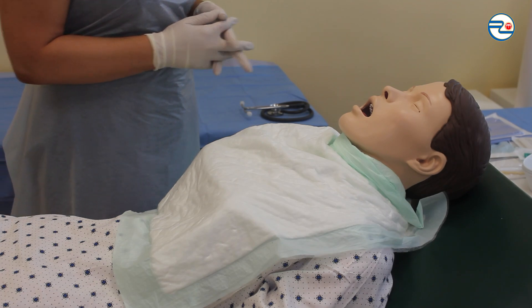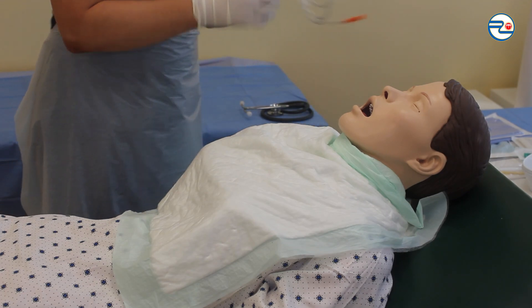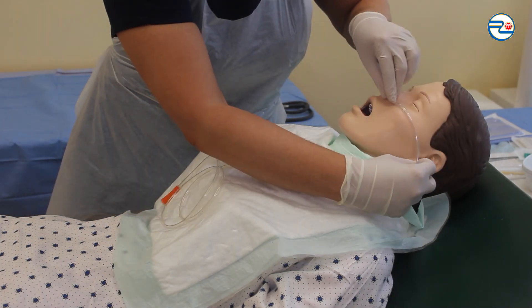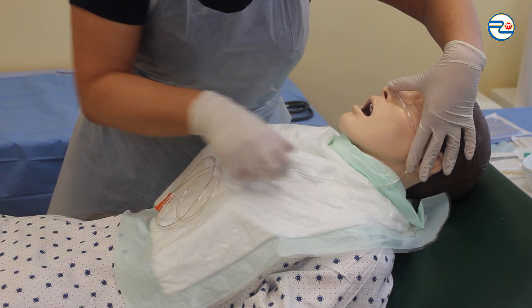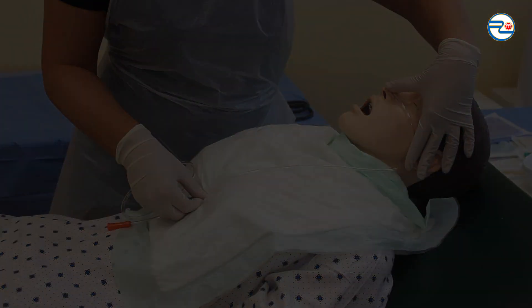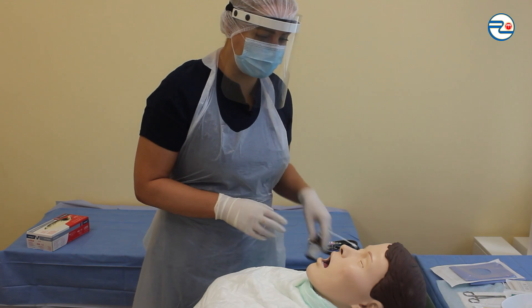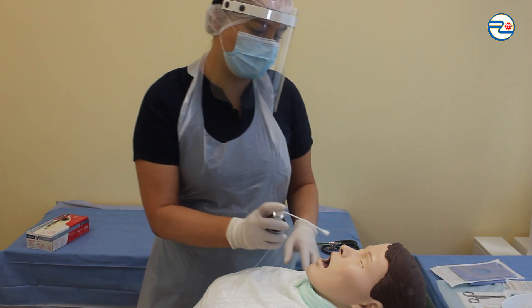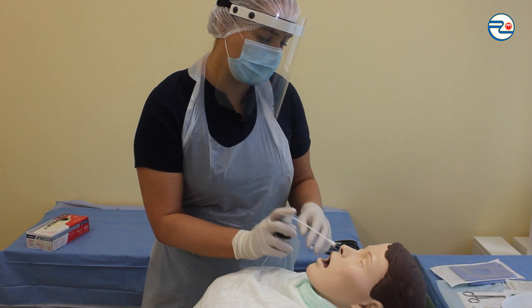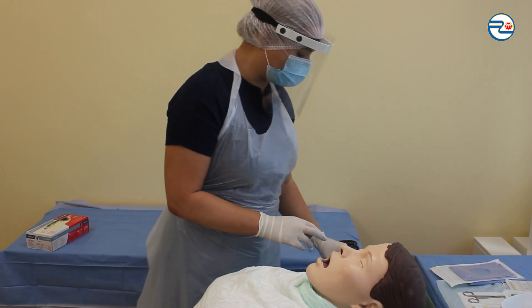Measuring how much tube I need to insert: from the tip of the nose, to the nipple of the ear, and to the xiphoid process. Because air goes better through the right nose cavity, I'm spraying local anesthetic into the right cavity and waiting about 1 to 2 minutes.